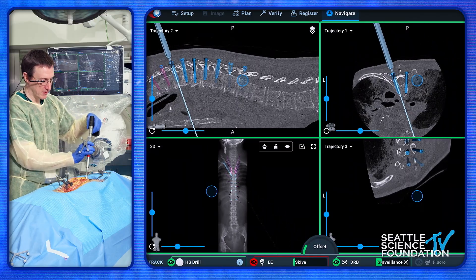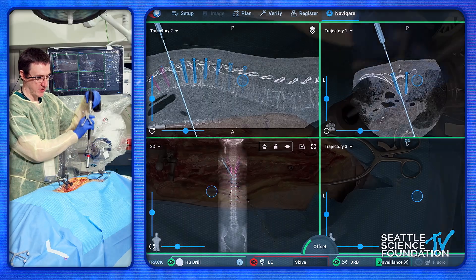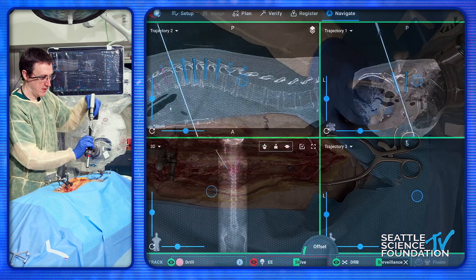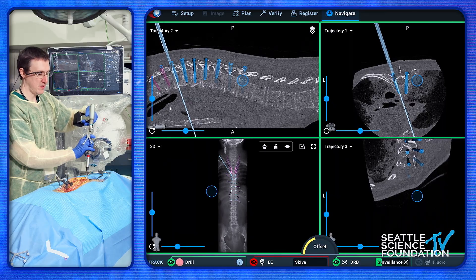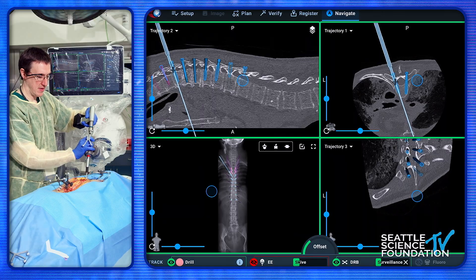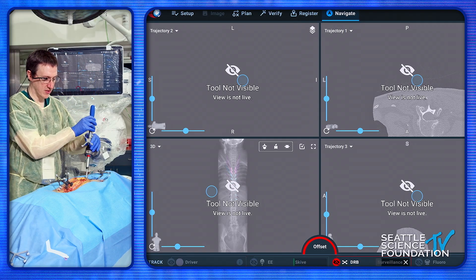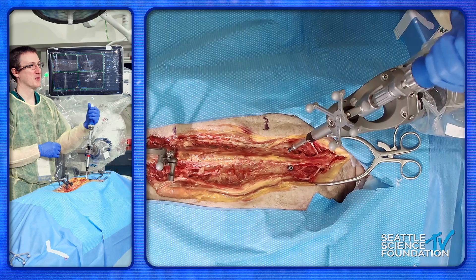Here we're just making a little tiny divot, then I take my drill and make sure I'm in line, getting my proper trajectory. It looks like it's doing pretty well — going full speed. Normally I would tap, but with the larger screws, again we're using smaller screws here, so it's really not necessary. The drill is the correct size and there we go, getting our screw back.